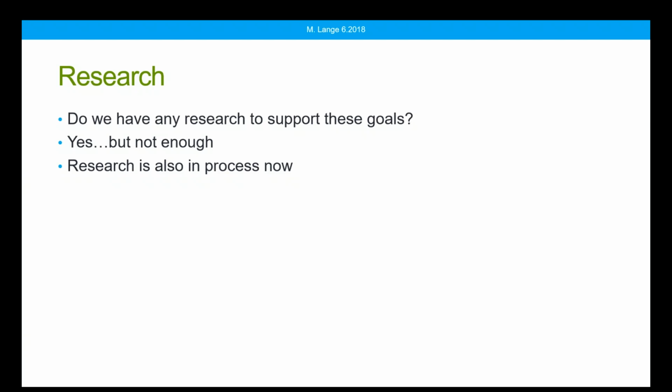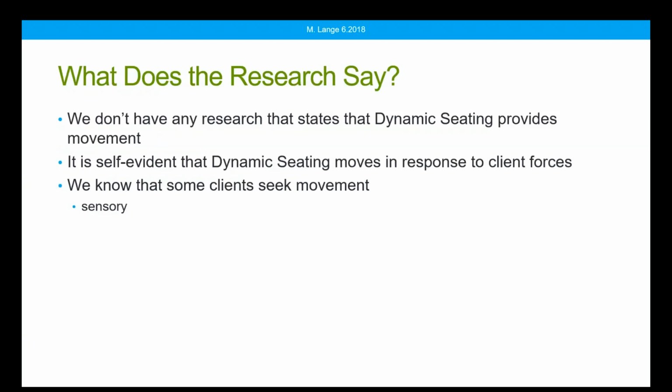Dynamic seating has actually been around for a while, but is seeing somewhat of a resurgence in clinical application. I think part of it's because we have some newer product options over the last number of years that weren't available to us before. With that said, dynamic seating does tend to be used more outside of the United States, in Europe and in Canada, and so some of the research is coming out of those areas where funding is sometimes more successful. We'll touch on funding before the end of this webinar as well.